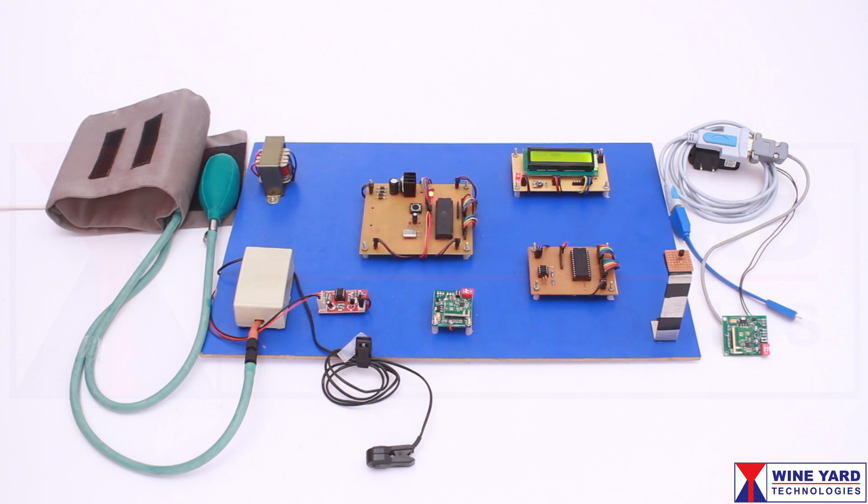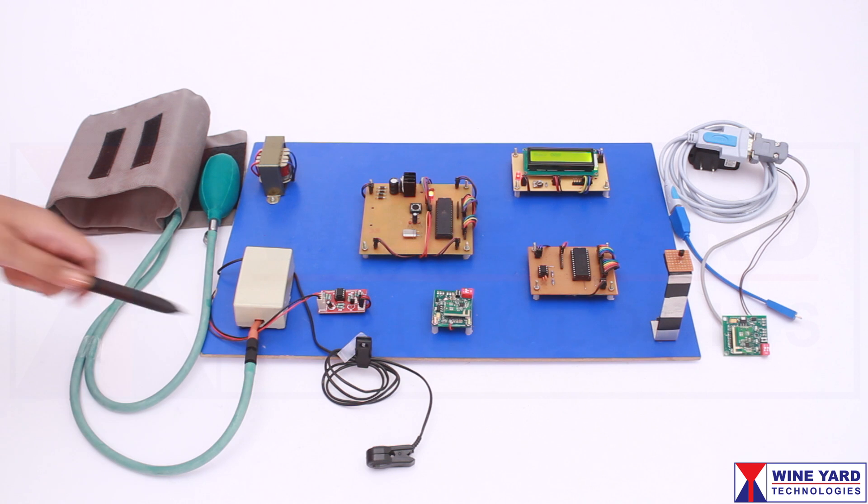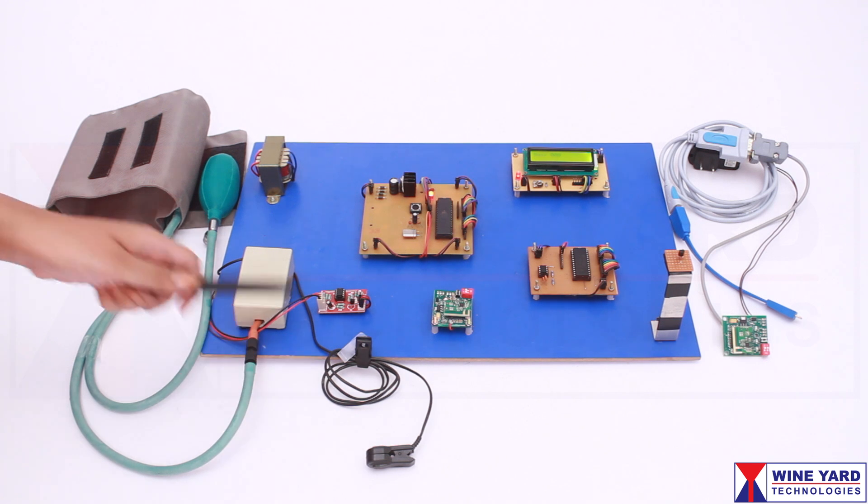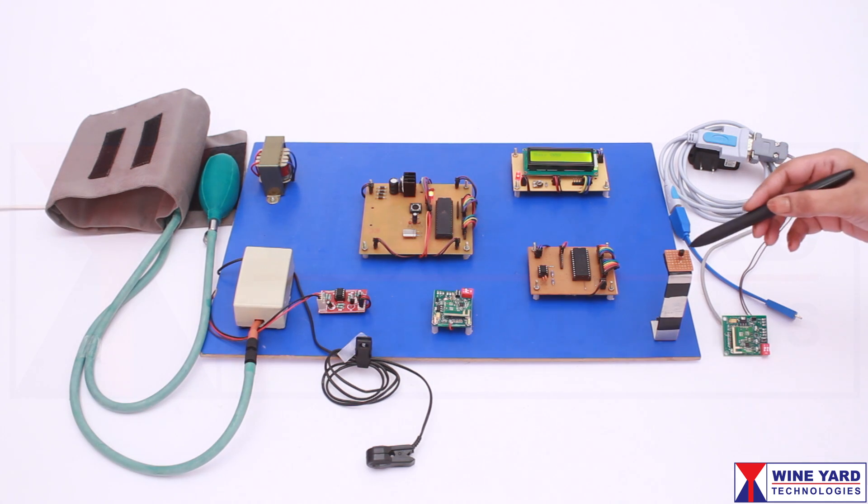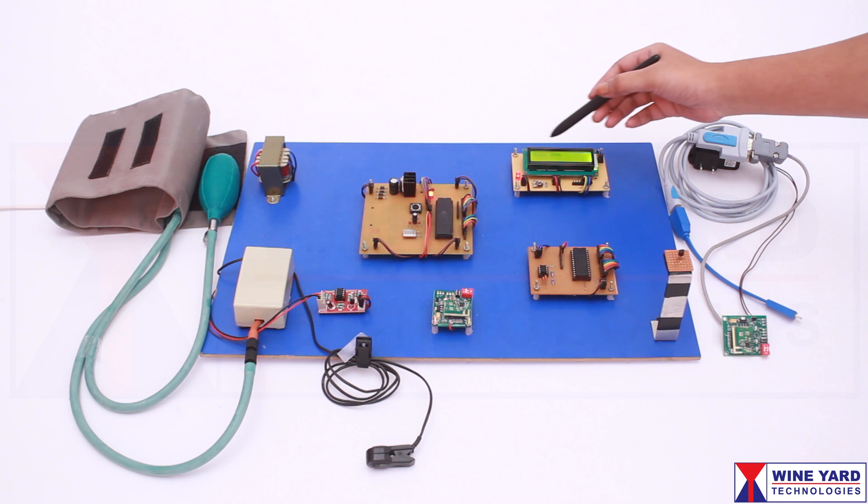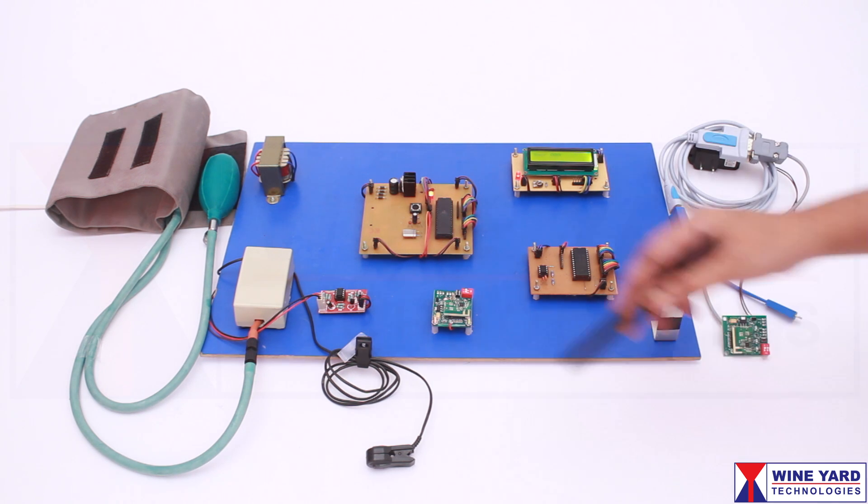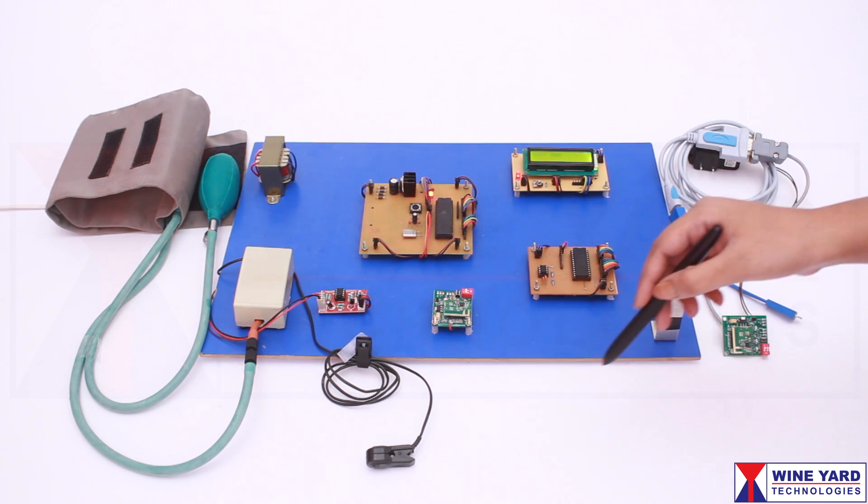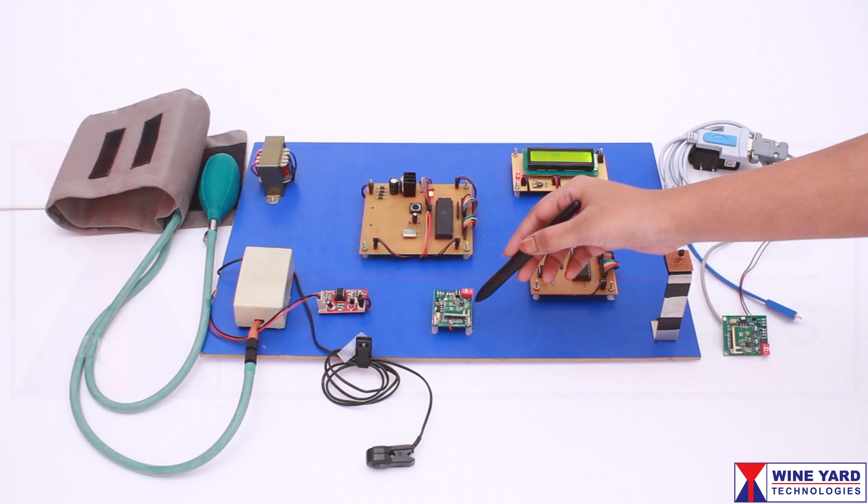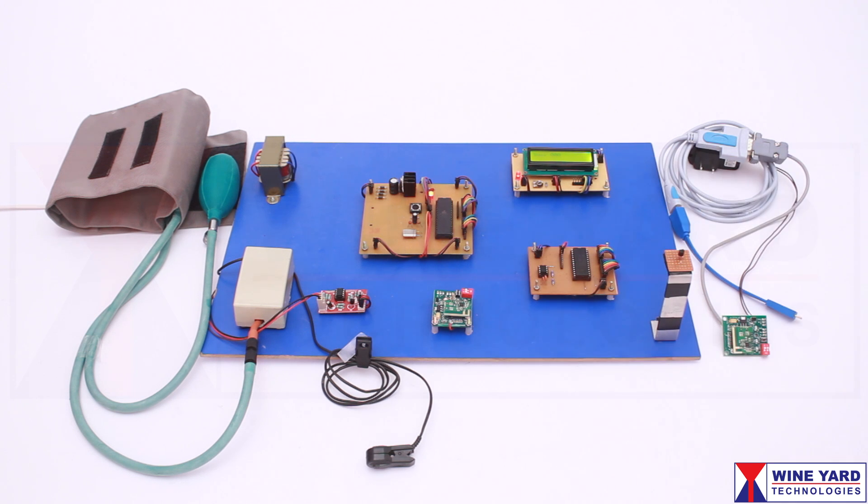This project is a Zigbee-based patient monitoring system with remote doctor reporting. The project measures heartbeat, blood pressure, and body temperature of a person and displays them on the LCD. A doctor can monitor these parameters from a remote place using Zigbee communication.